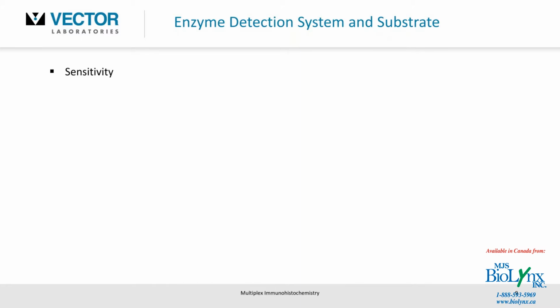sensitivity. Maybe you're using a one-step polymer base for an abundant antigen already. Maybe this second antigen has been upregulated. Maybe it's even of an unknown expression level. In that case, I would highly recommend going with a more sensitive detection system and a very sensitive substrate. And we'll cover some of that a little later on about the substrates. So just bear in mind the level of sensitivity that might be required when introducing a second label.